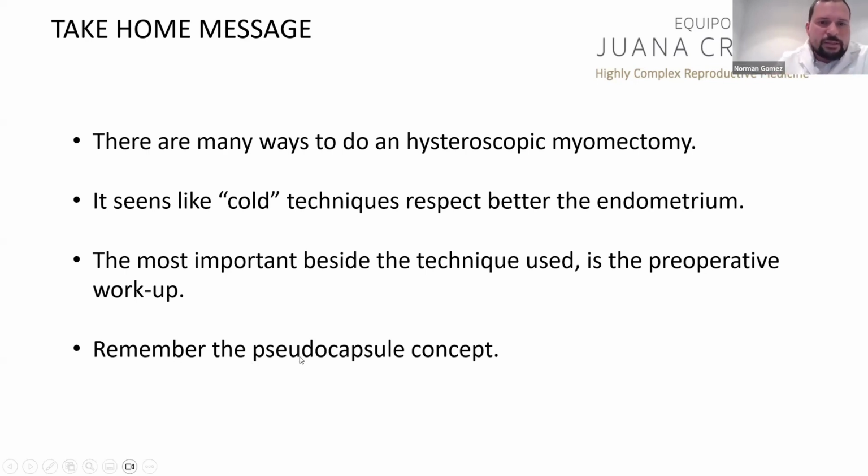And remember the pseudocapsule concept, because it's a key concept in this kind of surgery. The pseudocapsule is a plane that we can use to detach the fibroid very well, and we can reduce complications during the healing process of these patients. Thank you so much.